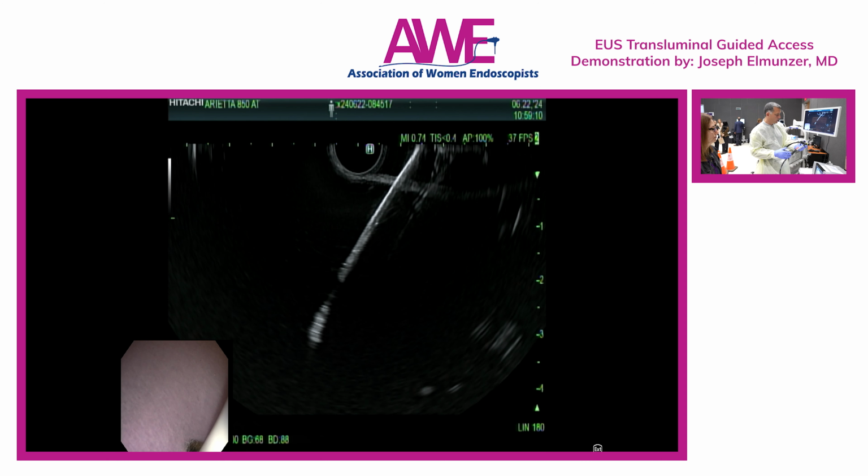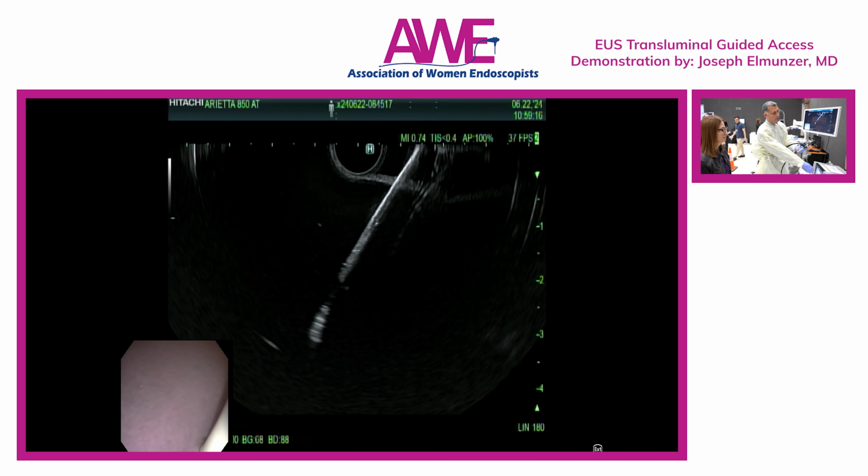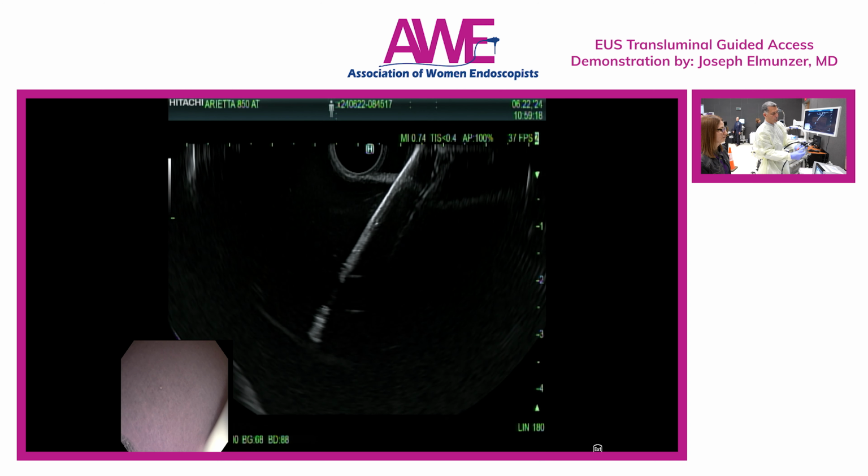So we're in good position, we're happy. I think we're far enough into the target. The catheter hub is locked. So now we're going to unlock the stent deployment hub. We do that by removing the protective yellow flap, a stupid thing I call it, but yeah. And then we will unlock the stent deployment hub.